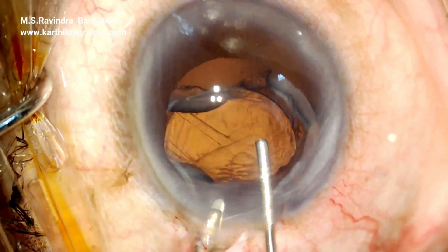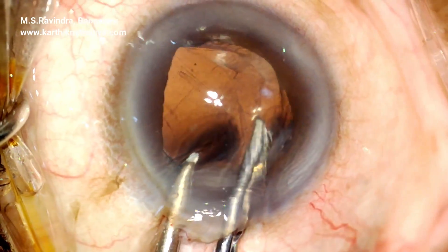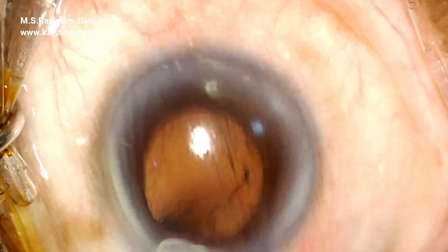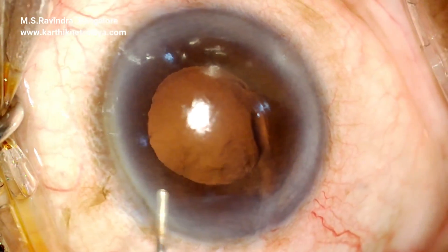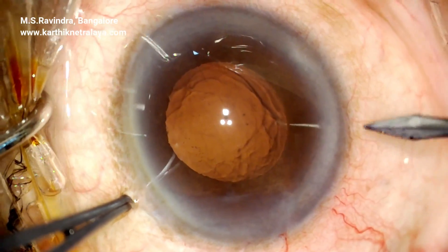The incision is slightly smaller than the width of the lens, so two forceps are held and the lens is squeezed out through the tunnel. Visco fills the eye.